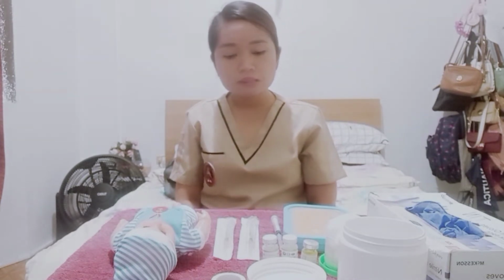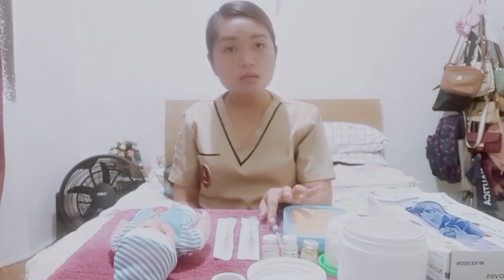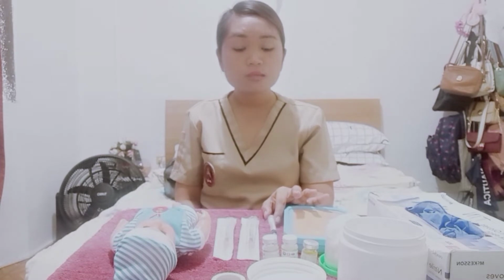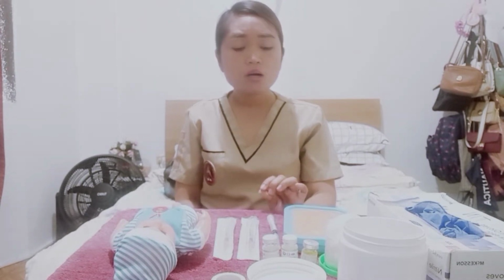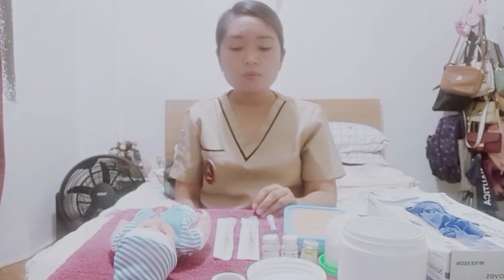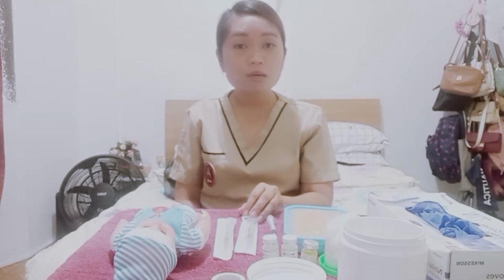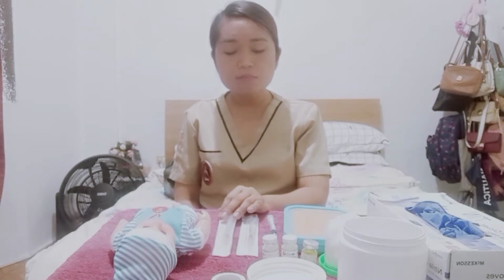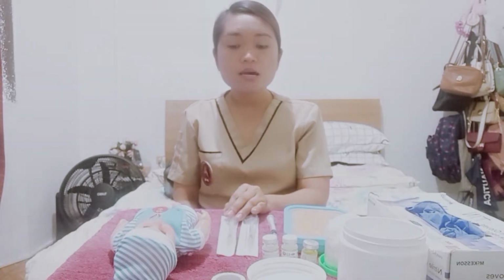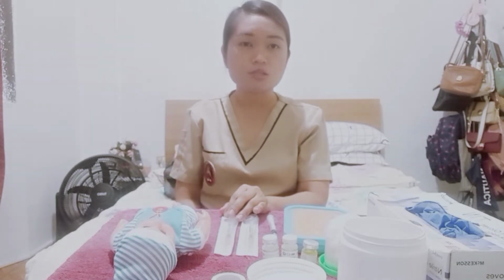We will be needing a 3 cc syringe with a 19 gauge needle that we're going to be using for reconstitution or for drawing up. We will also be needing a 23 gauge 25 mm needle for intramuscular injection, and at the same time, we are going to use a 25 gauge 16 mm needle for subcutaneous injection.